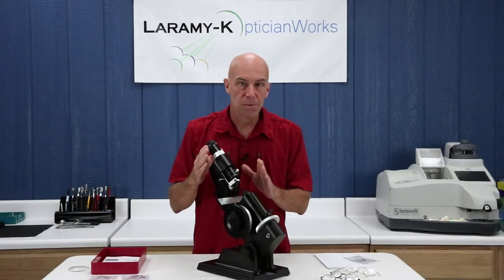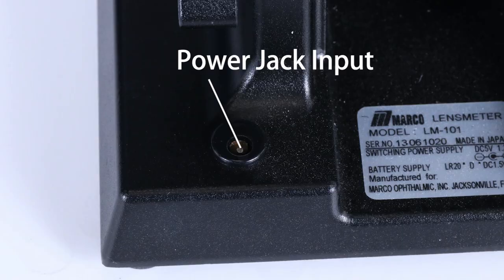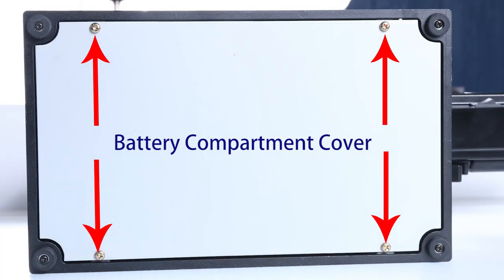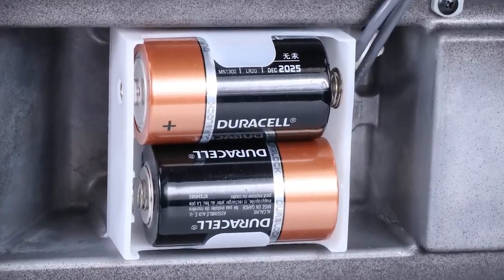One of the great things about the newest model of the LM101 is that it can be plugged in or it can be run off of batteries. To access the batteries, remove the four screws on the bottom plate and you'll see where the compartment is to load up your 2D batteries.